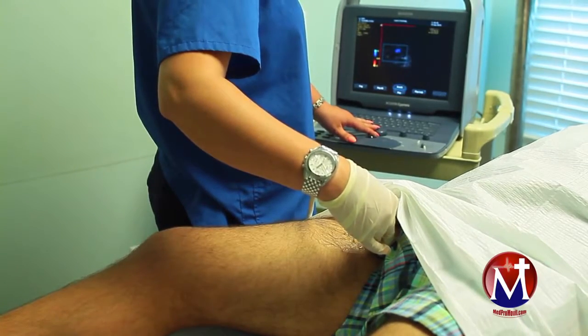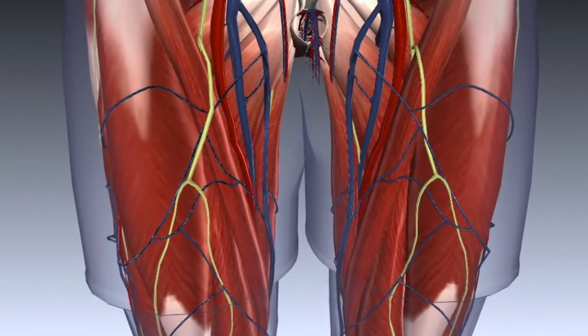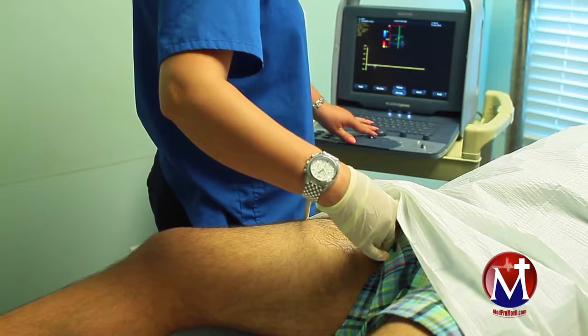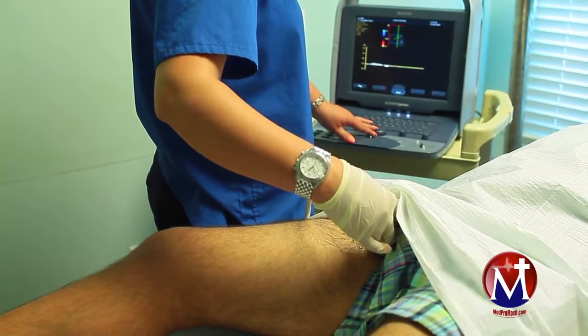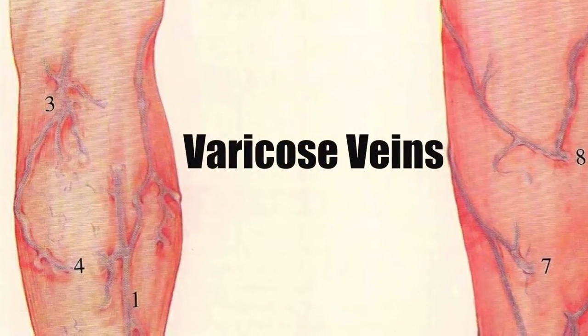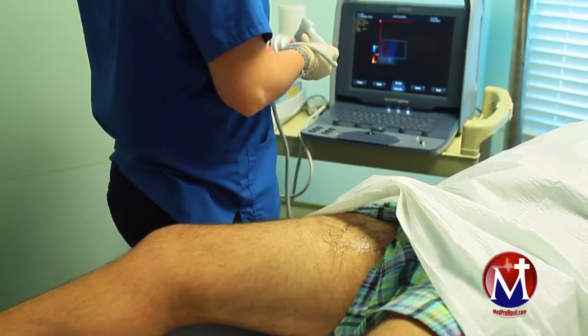Some of the main indications for venous Dopplers are deep vein thrombosis, extremity swelling, vein mapping needed prior to surgery, upper or lower extremity pain, skin discoloration, varicose veins, open leg sores, phlebitis, or edema.